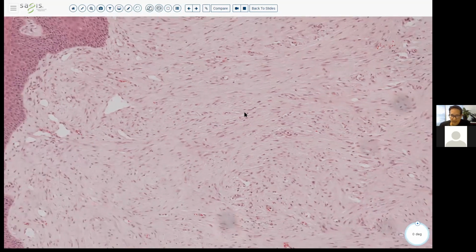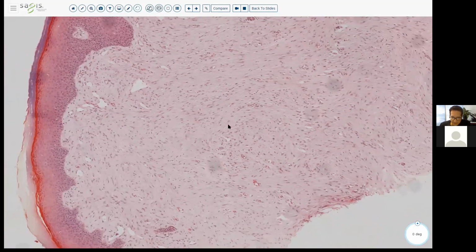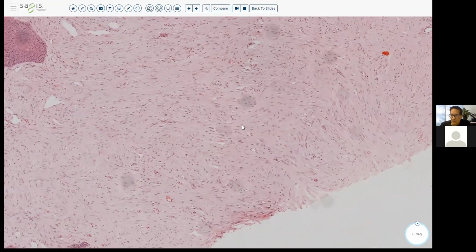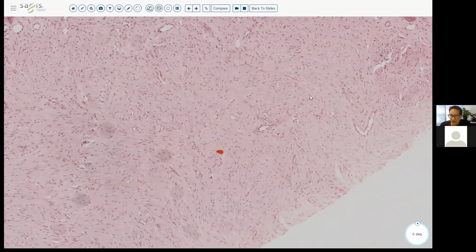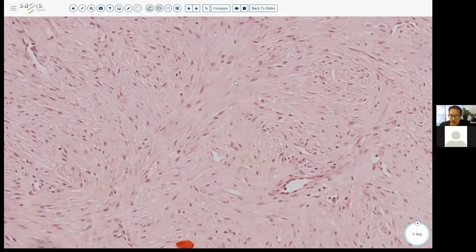You see these in little kids, but you can also see these in adults. So they've changed the name to inclusion body fibromatosis because it doesn't just occur in infants. But kind of the same theme that we've been going on in benign small spindle cells: you shouldn't see a lot of mitotic figures. You shouldn't see zones of necrosis. And really, you got to look around.